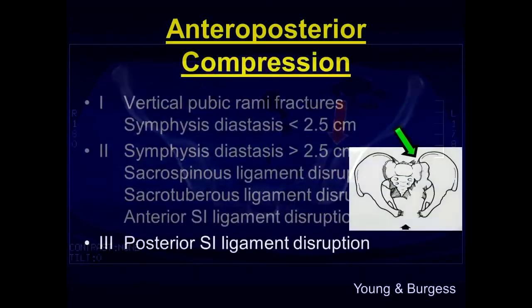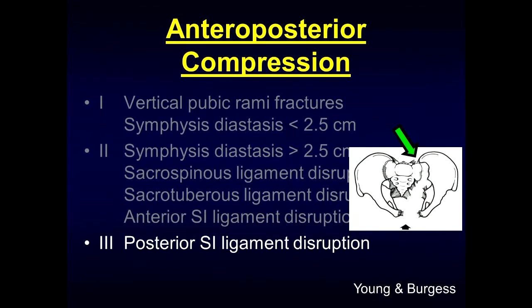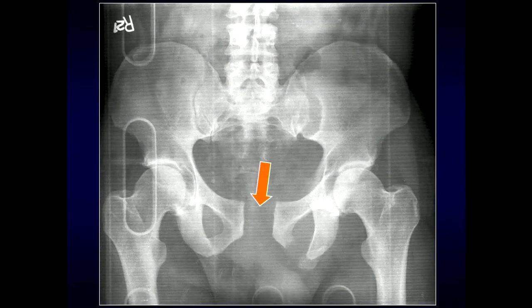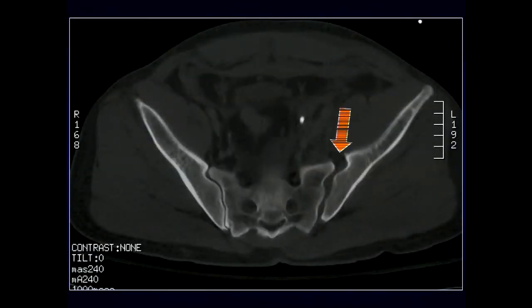AP compression type 3, in addition to the prior injuries, you're going to get posterior SI joint ligament disruption. In this individual you can see marked widening of the pubic symphysis, the rami fractures, as well as widening of that left sacroiliac joint. On CT, we see the anterior widening as well as the posterior widening compared to the contralateral side.